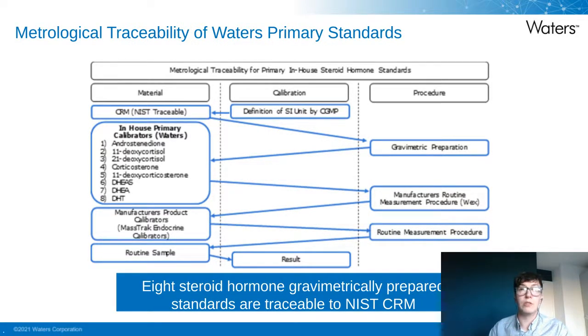So the metrological traceability associated with the MassTrak Endocrine Steroid Hormone Calibrator and QC sets is split across two processes.